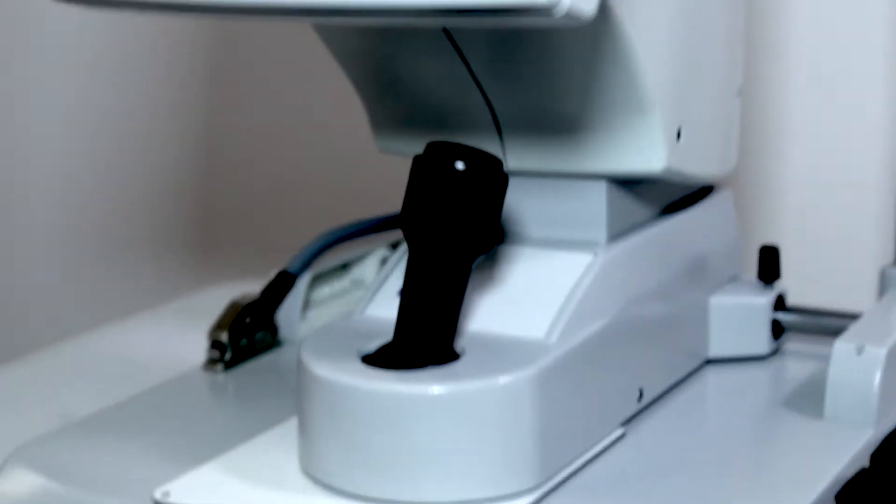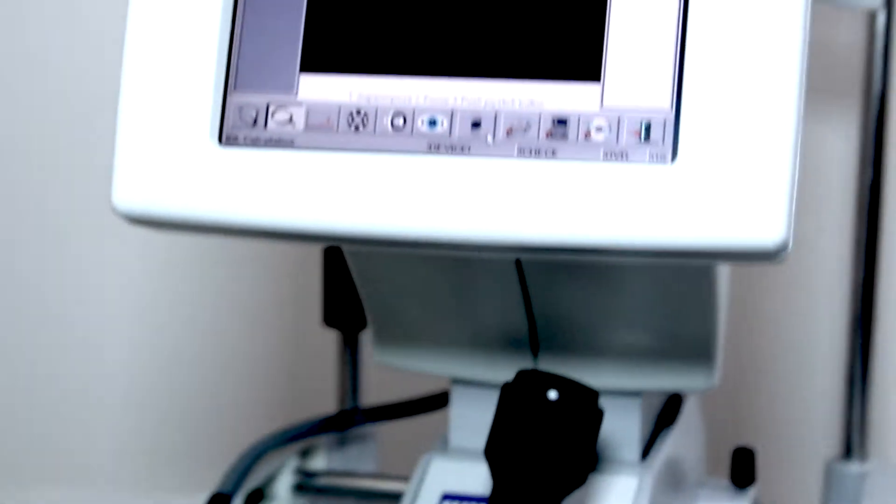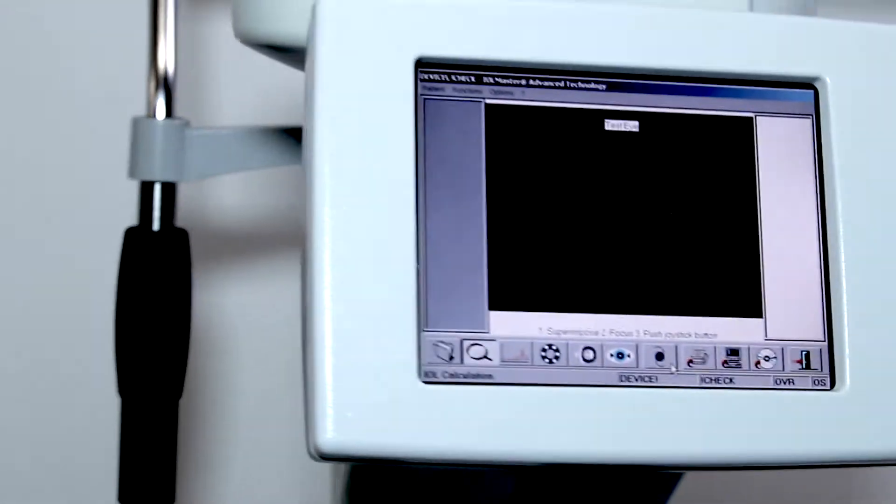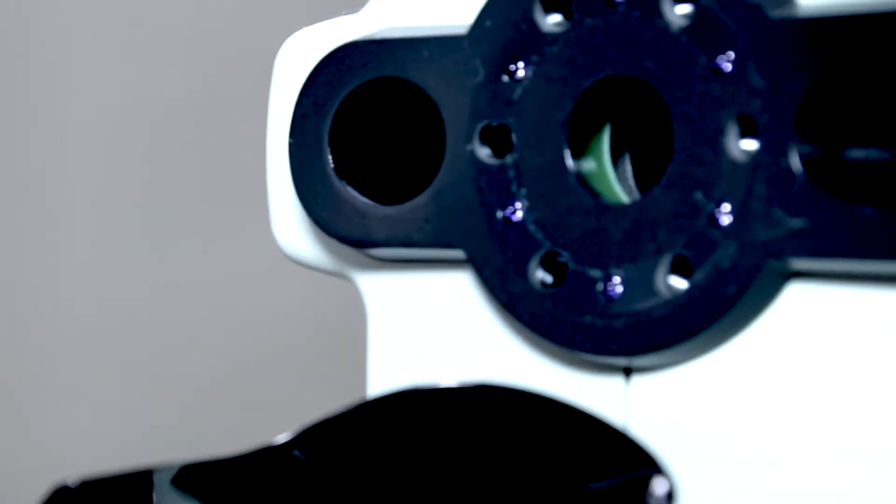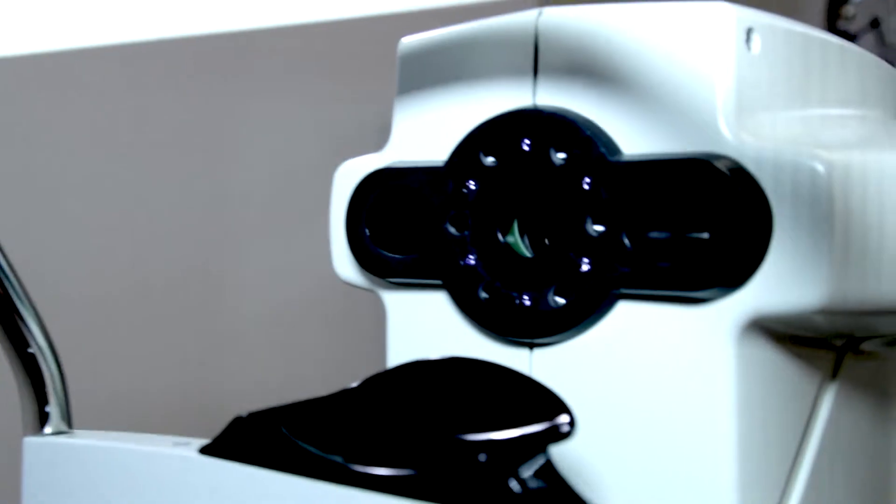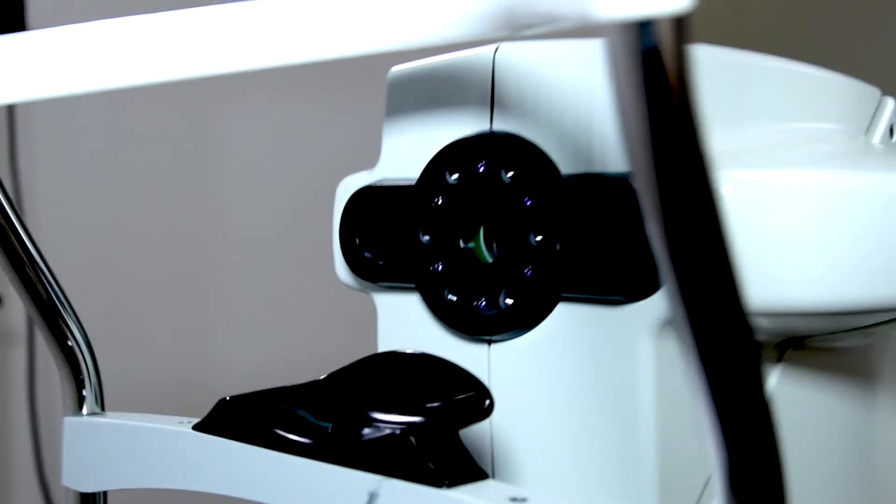The IOL Master uses partial coherence interferometry to measure the eye quickly and accurately and to provide the physician with information such as length of the eye, the curvature of the corneal surface, and the depth of the anterior chamber.